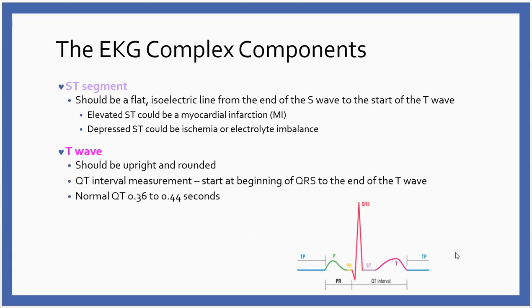So why is it an important consideration? When we look at this, this wave was depolarization, and then nothing's going on, and then at this point we've started to repolarize, shift things around. If the ventricle is cranky, and that cranky ventricle has an area that managed to fire off an impulse, if the impulse hits during this part of the cardiac cycle, it won't do anything. It won't cause the heart to respond in any way.